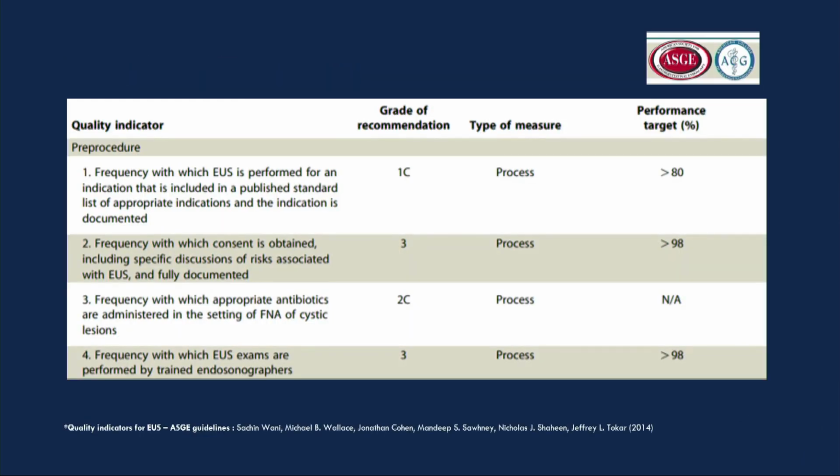I have no disclosures, so these are the American quality indicators. They are divided in pre-procedure, intra-procedure, and post-procedure. You can always see the grade of recommendation and also the performance target in percentage.